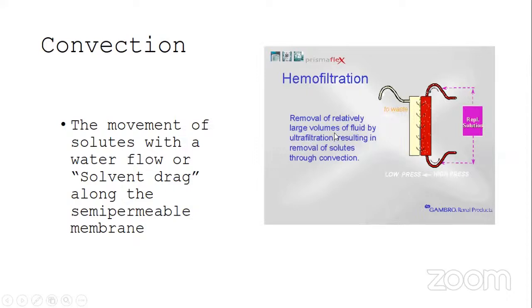So the removal of a relatively large volume of fluid by ultrafiltration causes the removal of solute through convection. This is the basic principle behind convection.